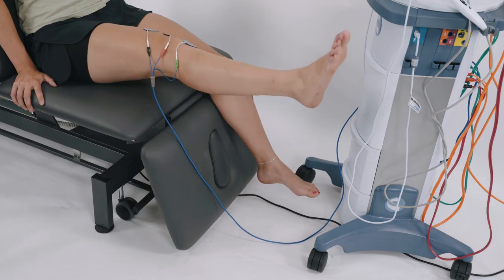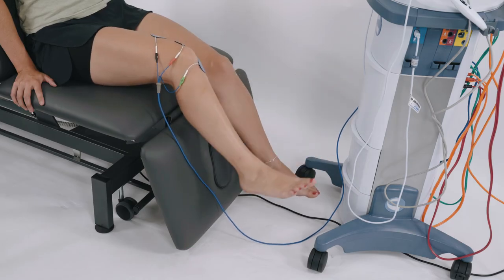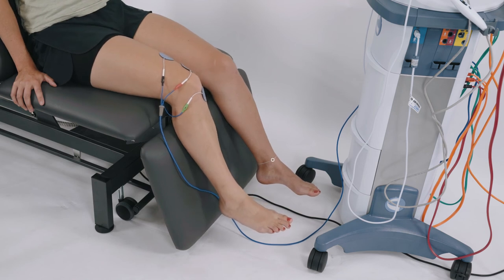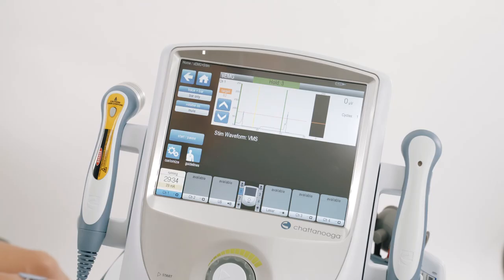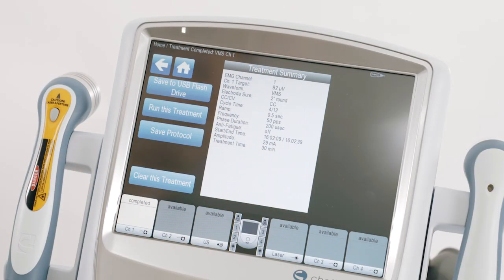The patient is prompted to contract their muscle. Once the patient achieves the threshold, the stimulation kicks in. The machine counts down — 5, 3, 2, 1 — through the contraction cycle. A treatment summary will be shown at the end of the treatment.